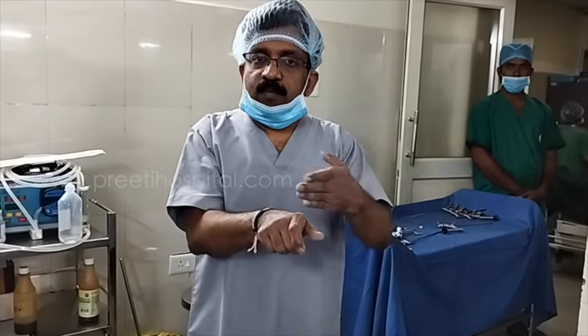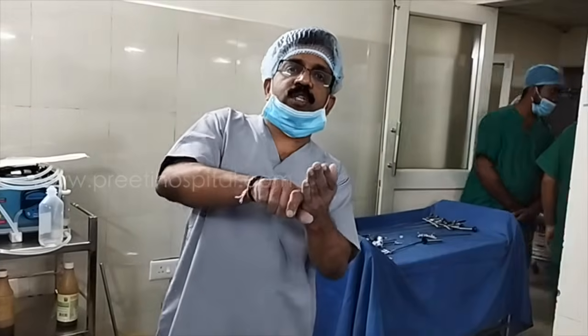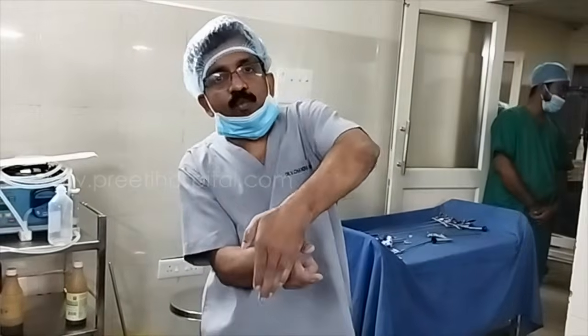So with this, we have been doing transrectal ultrasound for the last 15 years. For the first 10 to 12 years we were doing it with the Philips ultrasound probe. Now we have switched to BK ultrasound. We are understanding better. Most important in sagittal is rotation, not the up and down. In sagittal it comes from the side, so if you rotate, it comes from right to left. If you rotate anti-clockwise, it comes to the more right. So rotation is more important in the sagittal section, whereas in axial up and down is more important.